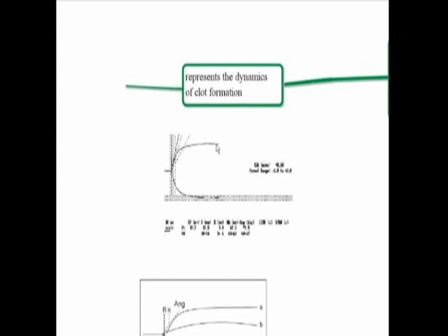Whereas a dodgy one will clot much slower, and it's not stable. It's stable, but it's not even. This has gone up here. It's like strong. It's gone up there. That's like an indicator of the strength. And that's stability. This one's stable-ish, even after a bit it starts going down, but it's not even that strong because the incline here is not as much as the normal one. So you can tell that this is somebody not clotting very well. This person is going to bleed, whereas that one is normal. So that's how this works.